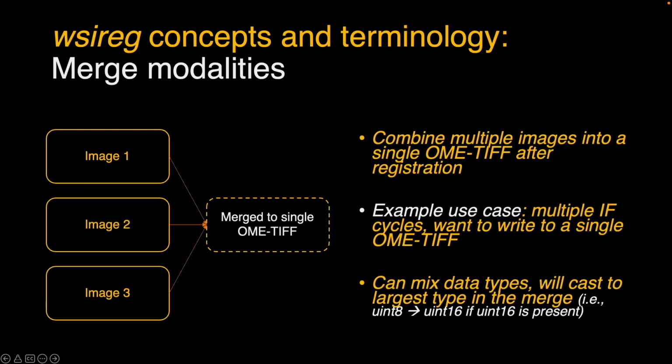The final wsireg concept and terminology to discuss during this workshop is the idea of the merge modality. In all the examples we've shown previously, we have multiple images, and after they're registered, each image has the same number of channels. It's all that same data, it's just registered when its output is the OME TIFF.